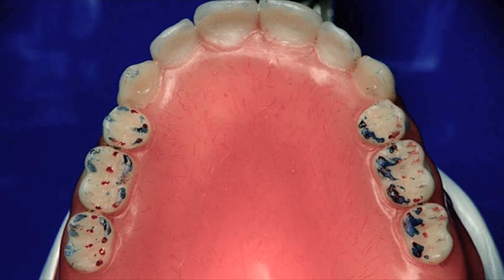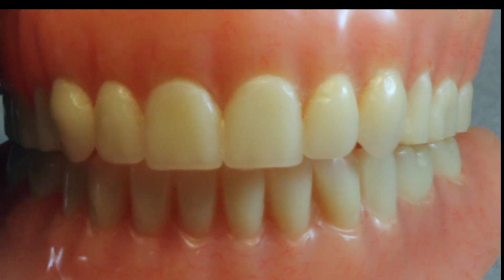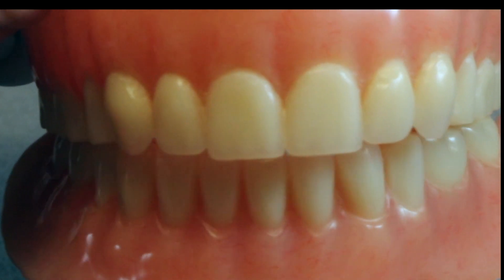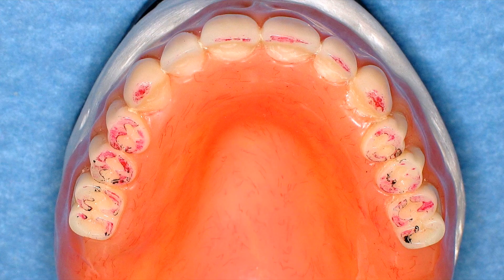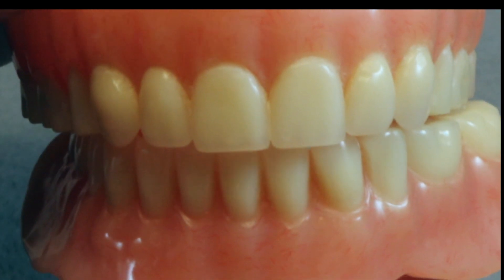Firstly, articulating paper marks are often difficult to interpret when the denture slides or twists during functional movements. Occlusal prematurities can cause displacement of the whole denture rather than creating clear, precise marking of the prematurities. When this happens, the clinician will often see a mass of unintelligible markings or numerous false markings that result from a shifted position of the prosthesis.